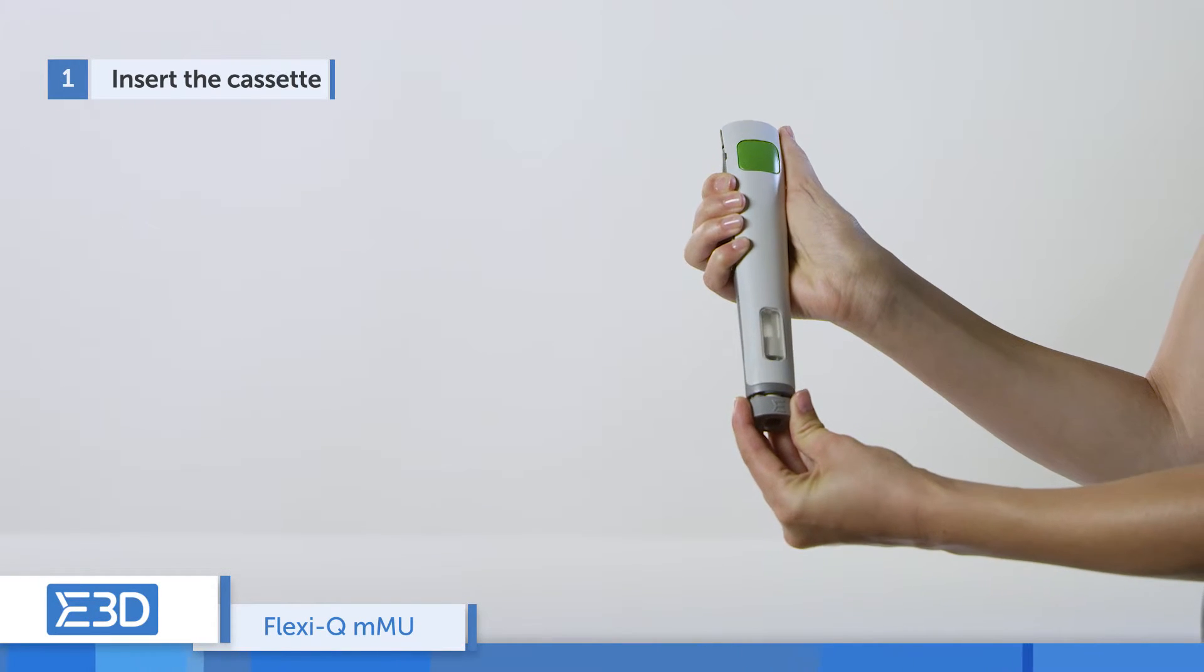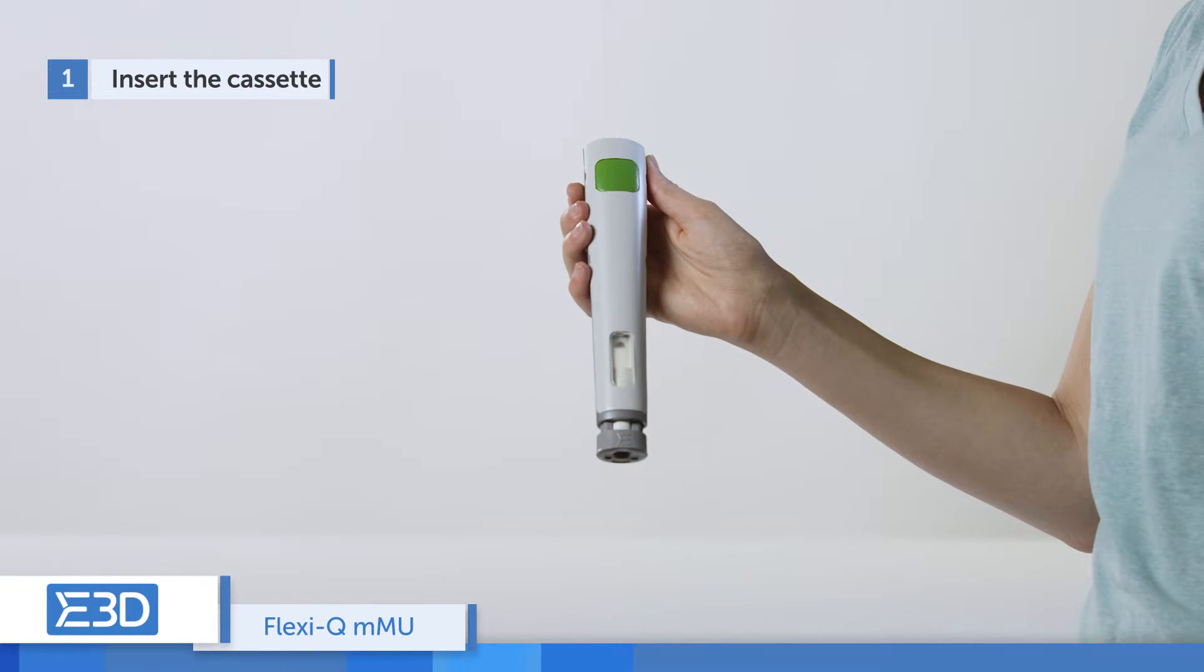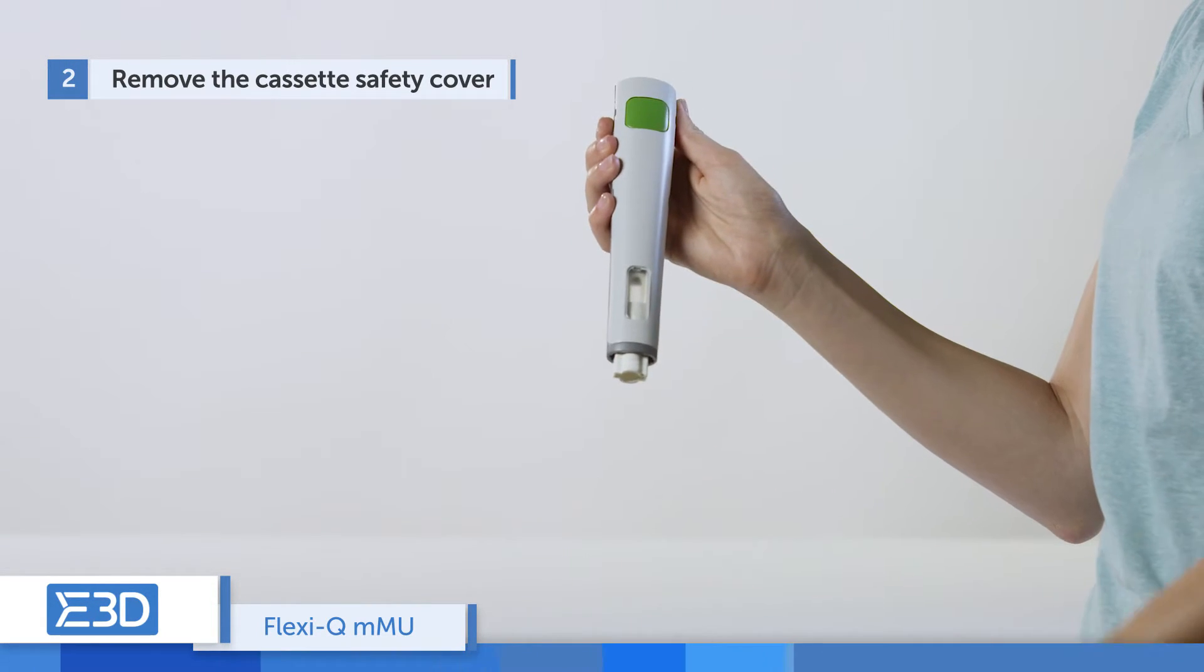Insert the disposable cassette into the reusable device. An audible click indicates that the cassette is fully inserted. Remove the cassette safety cover.